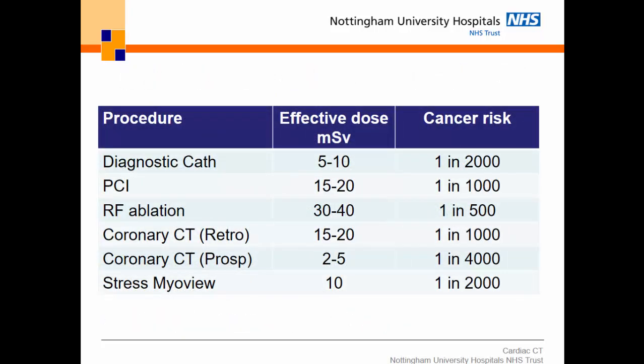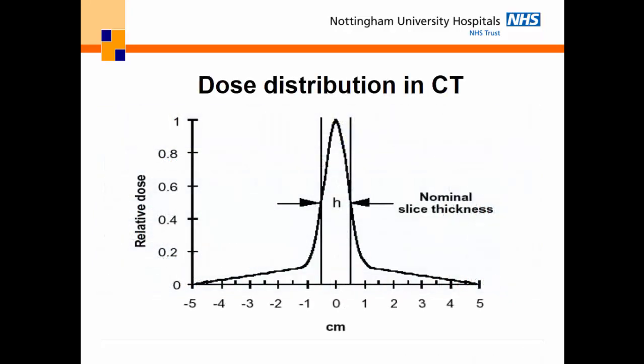Okay, so we've put some figures up here for some of the different techniques just for comparison with you, and also their cancer risks. These risks vary. They vary in time in the UK, the rest of the world, and they'll vary by centre as well. So you ought to know roughly what you're comparing against in terms of what the other techniques give you in terms of radiation exposure, so you can weigh up the risks and benefits of each technique.